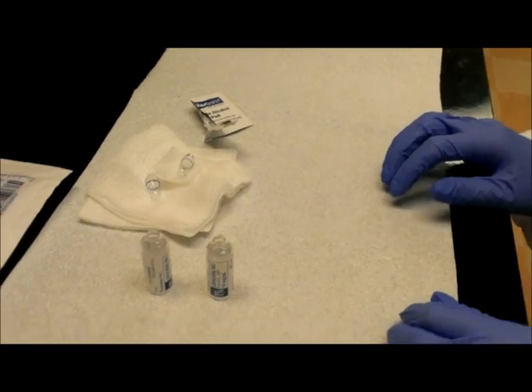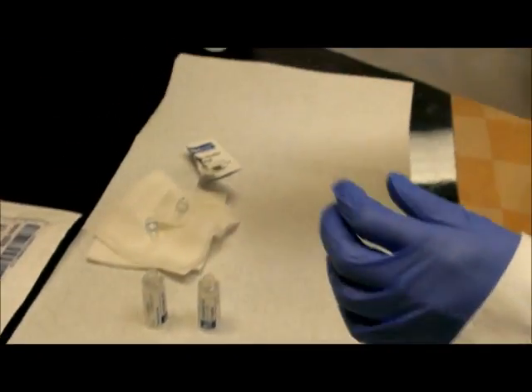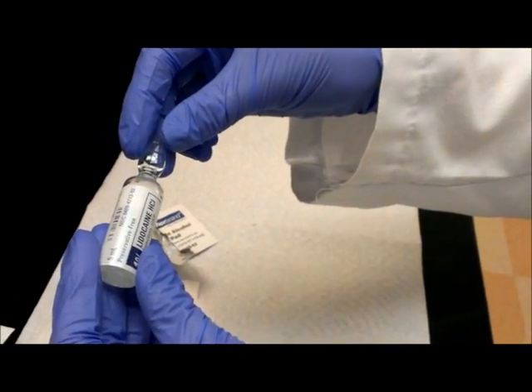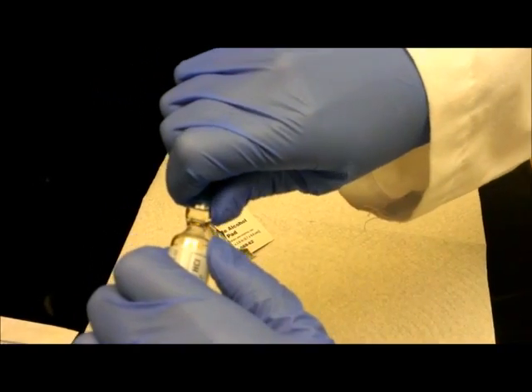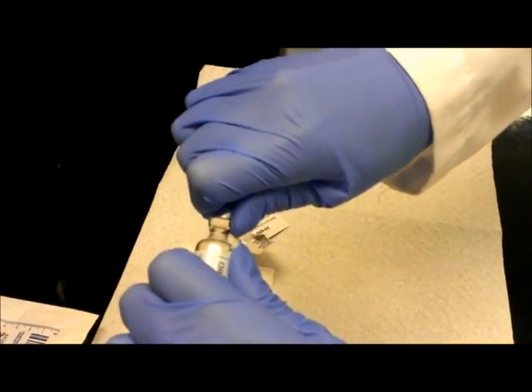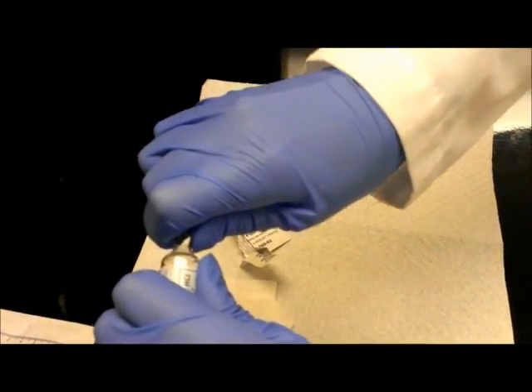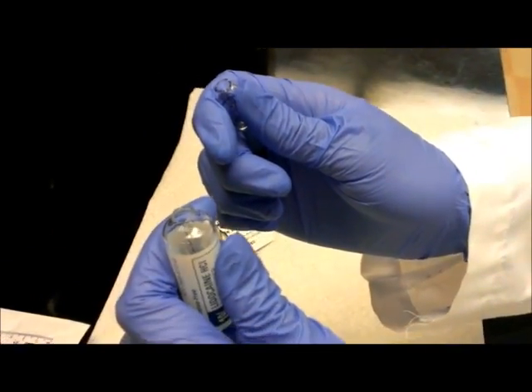Our favorite technique involves specific placement of your fingers. It does not require gauze but requires specific finger placement, which makes it a much safer technique. Christine is placing her thumbs facing each other on each side of the ampule neck. She then applies steady pressure while holding the ampule at a slight angle. This will protect your fingers and is the safest method that we have found works best.